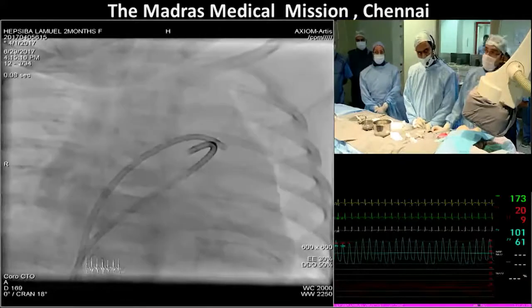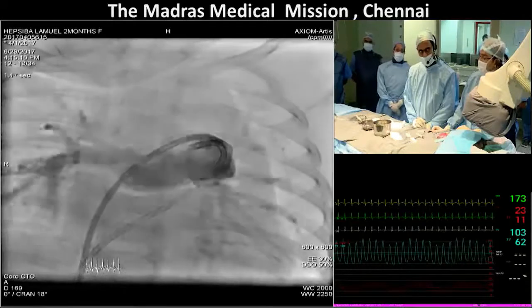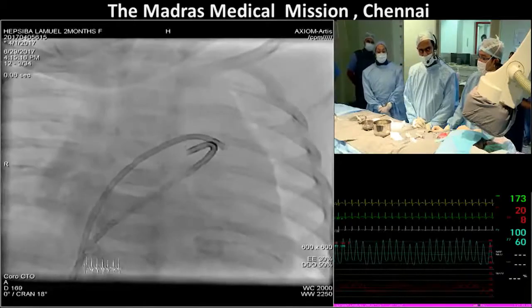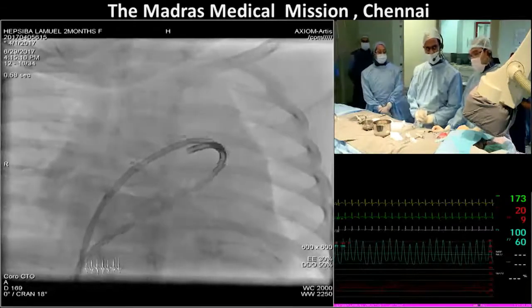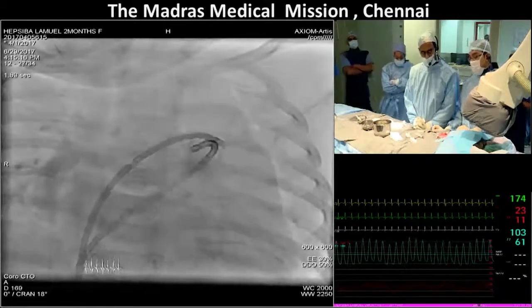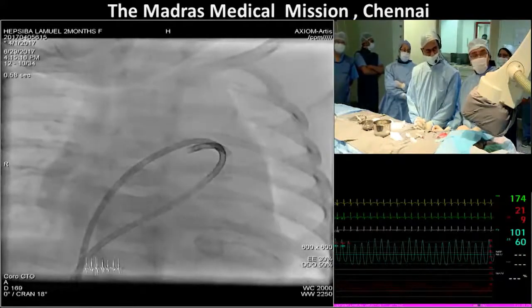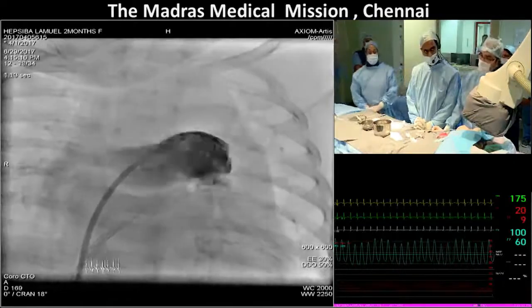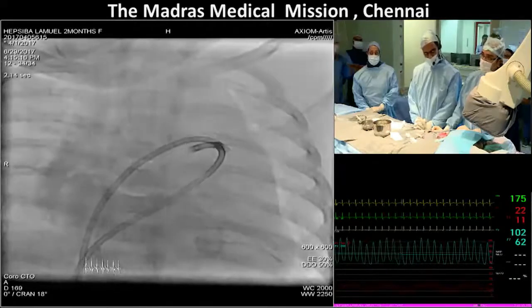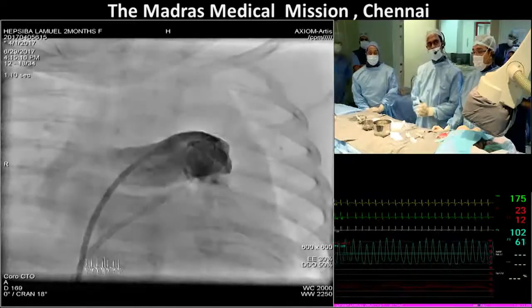Hello? Yeah, so personally, this is Jim Locke. I'm a little tiny bit speechless here. In the 30 years that I've been in Boston, we've probably done 50,000, 60,000 catheterizations, and I don't think I've seen this more than twice. Whatever this is, it is extremely unusual. As a result, I'm sure transcatheter therapy makes sense here, but you're going to be making this up as you go along, which we've never done before, actually, in the history of the field. So I'm very interested to see how you're going to handle this.